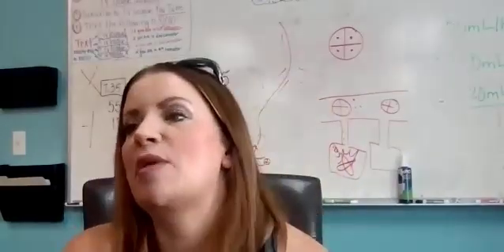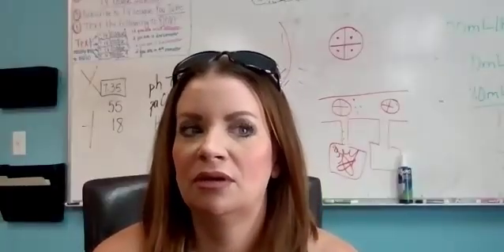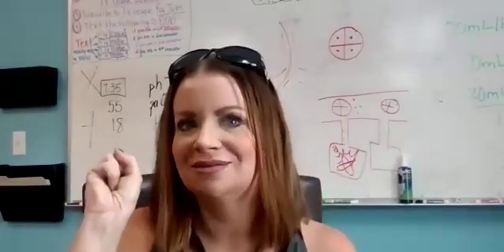Non-invasive ventilations. This is our BiPAP and CPAP. What do we say the difference was between BiPAP and CPAP? CPAP is continuous pressure. The alveoli stay open. BiPAP is like, yeah. Okay. How do you put it on?